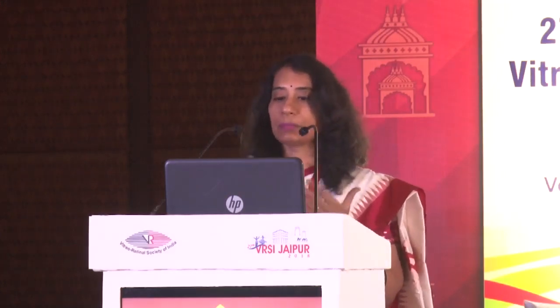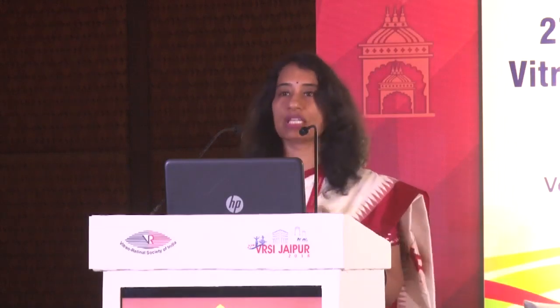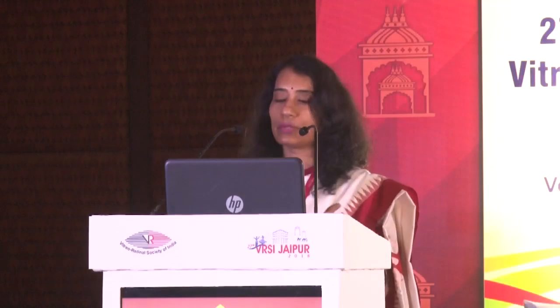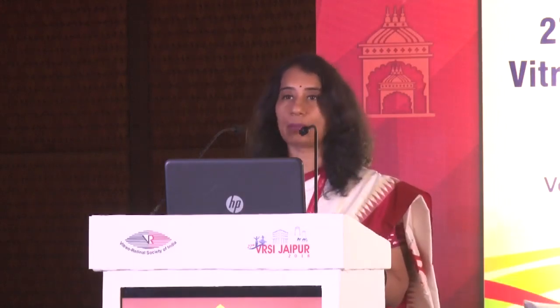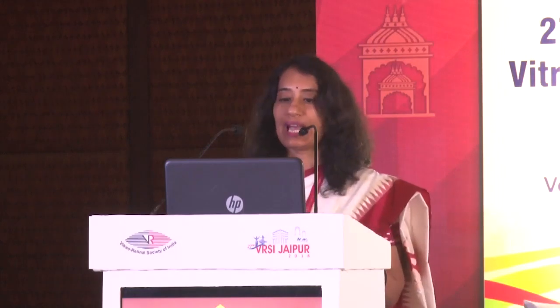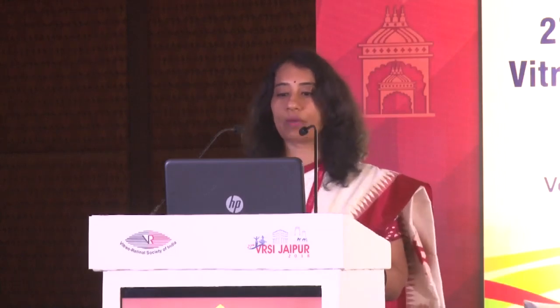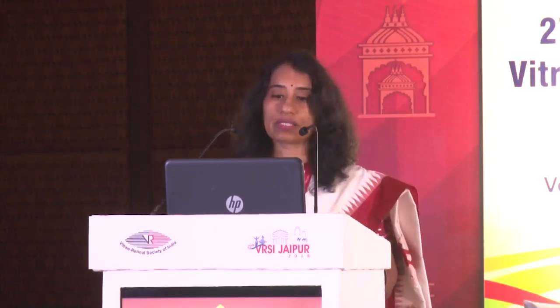And depending on the presentation of the ERG, you can guess whether it's an autosomal dominant cone dystrophy or autosomal dominant cone rod dystrophy, which has both a flicker delay as well as an amplitude reduction. And we have rod and S-cone monochromatism, which present from birth. In both, actually, the 30 hertz flicker and the photopic ERG are extinguished, whereas the scotopic responses are normal.